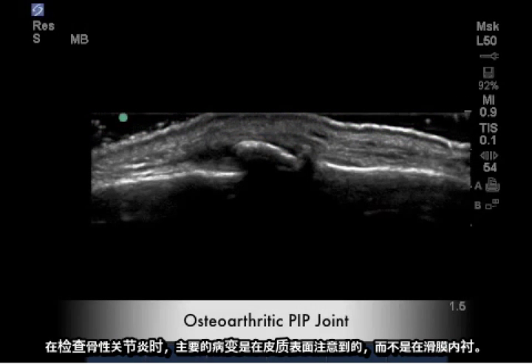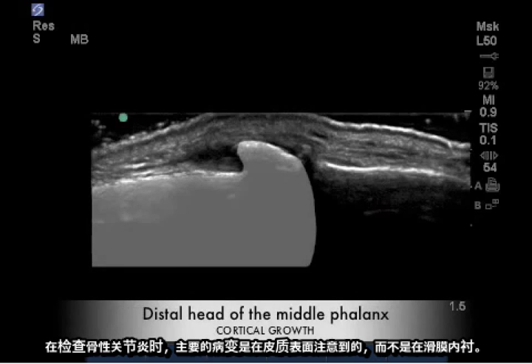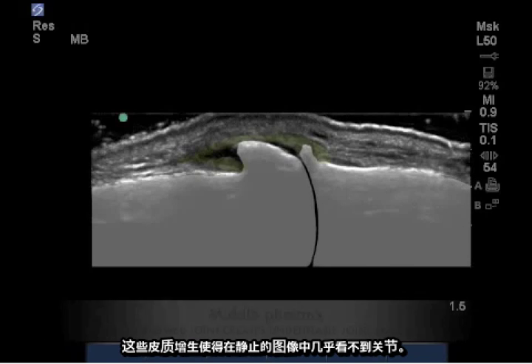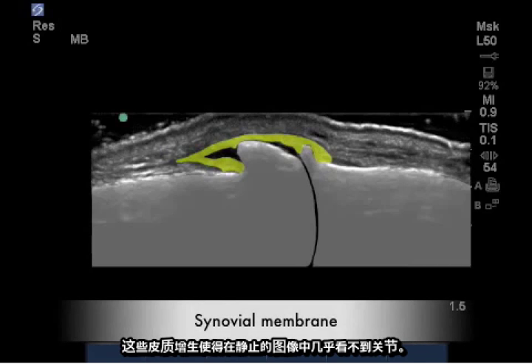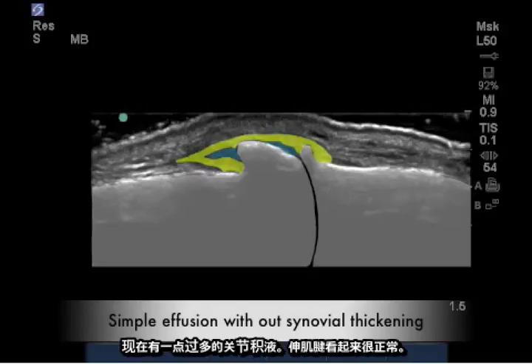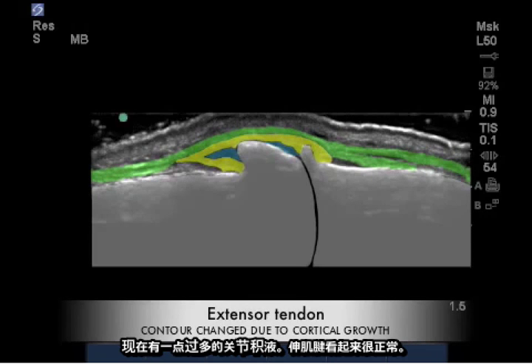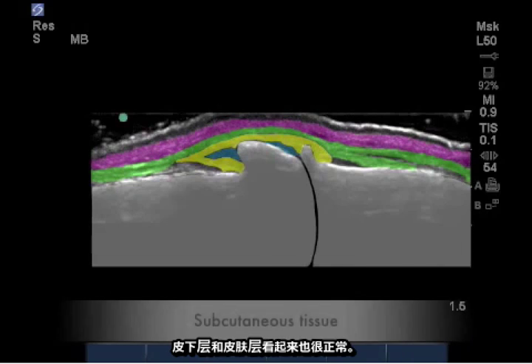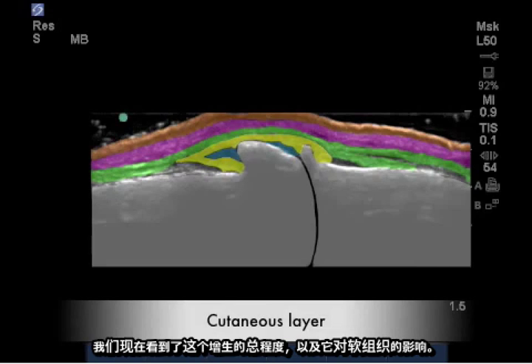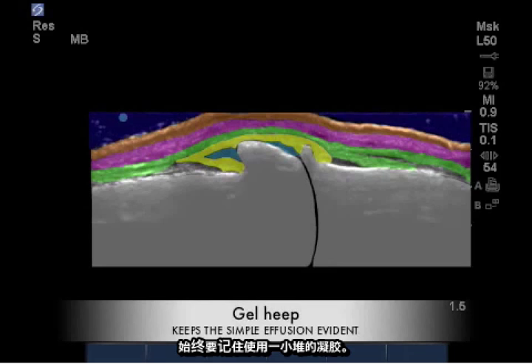When evaluating osteoarthritis, the primary changes are observed in the cortical surface rather than the synovial lining. These cortical growths make the joint almost impossible to see on a static image. In yellow is the synovial lining, which appears normal in thickness. Here we have a little excess joint effusion, and the extensor tendon appears fairly normal, as do the subcutaneous and cutaneous layers. To see the full extent of this growth and its effects on the soft tissue, always remember to use a gel heap.